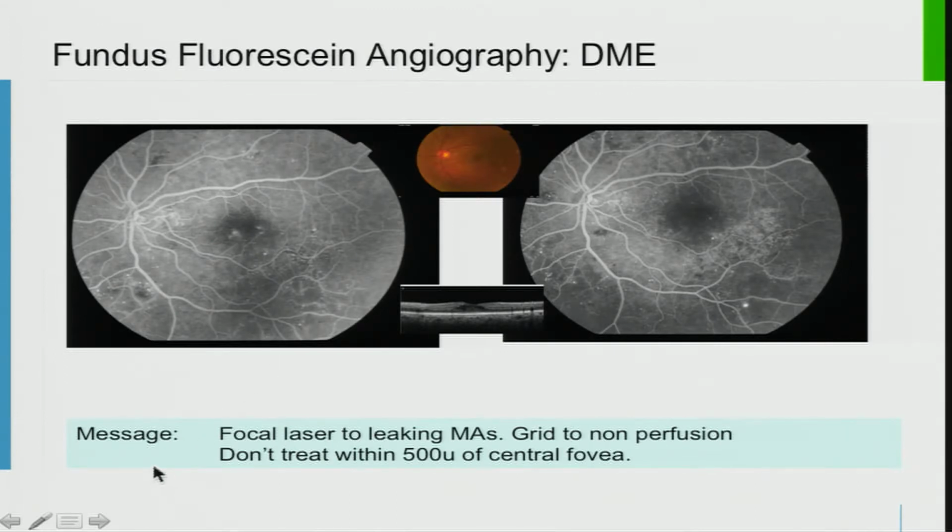So an important thing to know is that focal laser has to be done to your leaking microaneurysms. You can do a little grid to your non-perfusion, but remember not to treat within 500 microns of your central fovea. So these MAs should not ideally be touched.